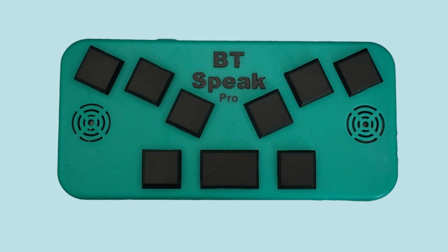Dots 3 and 6 do the same thing for characters. So if I press dot 6 chord, H, I, N. I'm on the word things, N, G, S. And if I press dot 3 chord, I move back. N, I. And if I'm on the letter I, if I press dots 3 6 chord, it reads the current character. I. And if I press it a second time, it reads the phonetic word for that letter. India. It said India because I'm on the letter I. If I were on the letter A, it would say alpha.